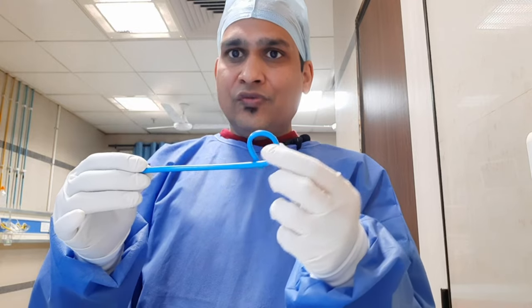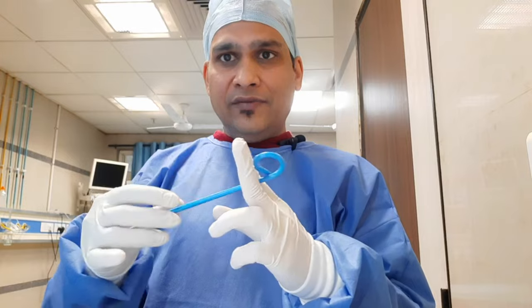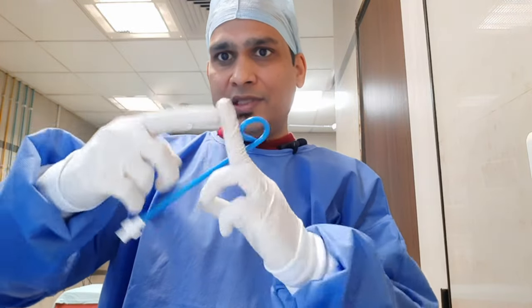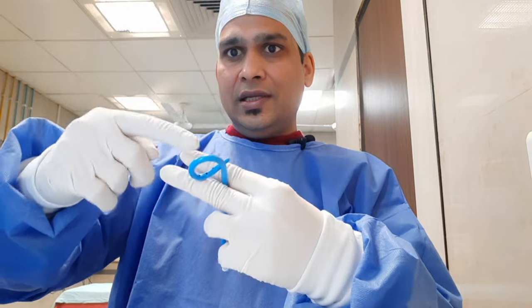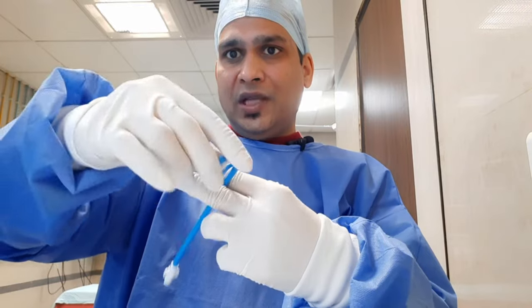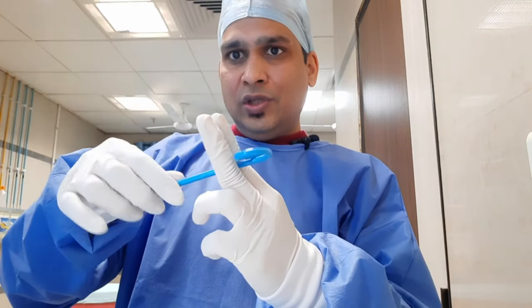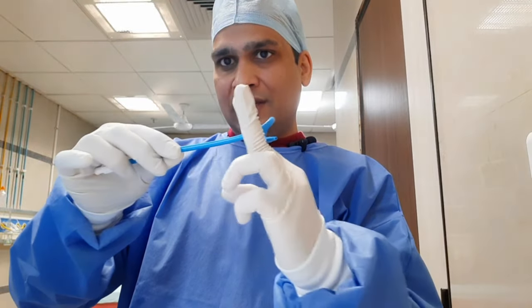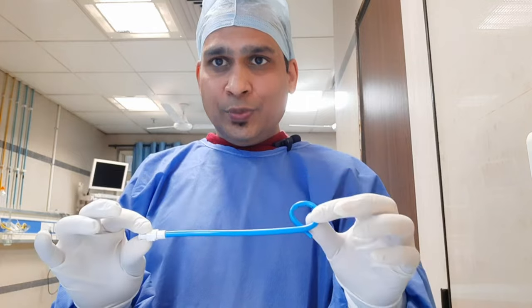The coiling of the tip resembles the tail of a pig — that is why it is called a pigtail catheter. The use of this coiling is that once it goes inside the pleural cavity, it will approximate against the ribs, so it will not come out. This is the use of the pigtail design. That is all about the pigtail catheter.